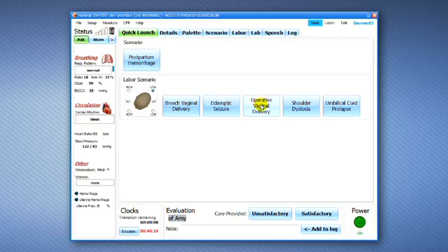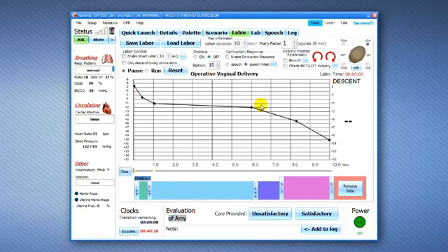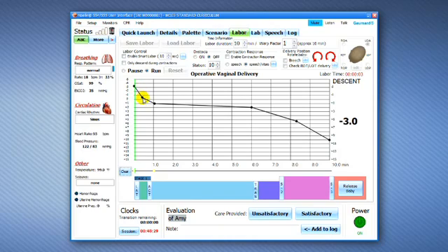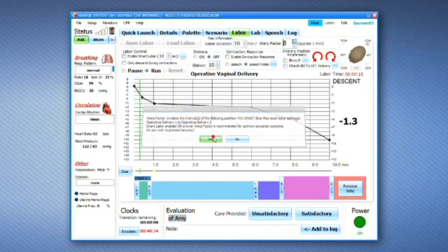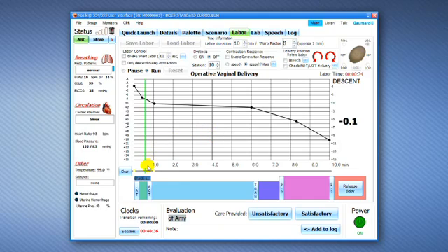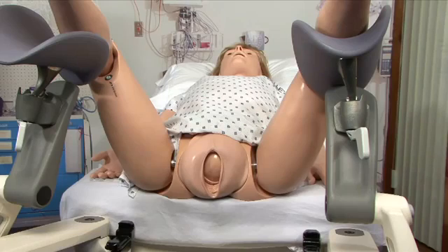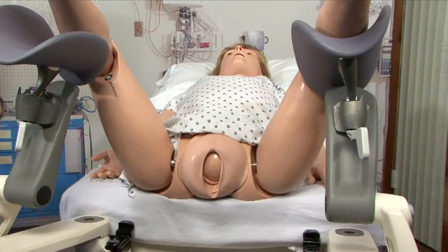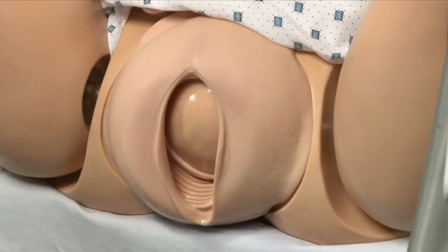To start the delivery process, click the Operative Vaginal Delivery Scenario button. The GoMard UI software will automatically switch to the Labor tab. Load the Operative Vaginal Delivery Scenario and initialize the delivery mechanism. The fetus will begin to descend as indicated by the descent curve and the vertical progress bar.